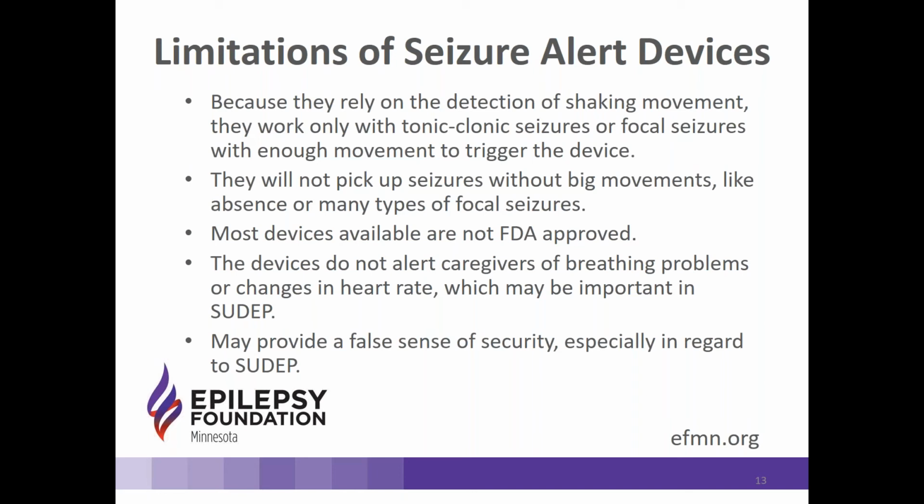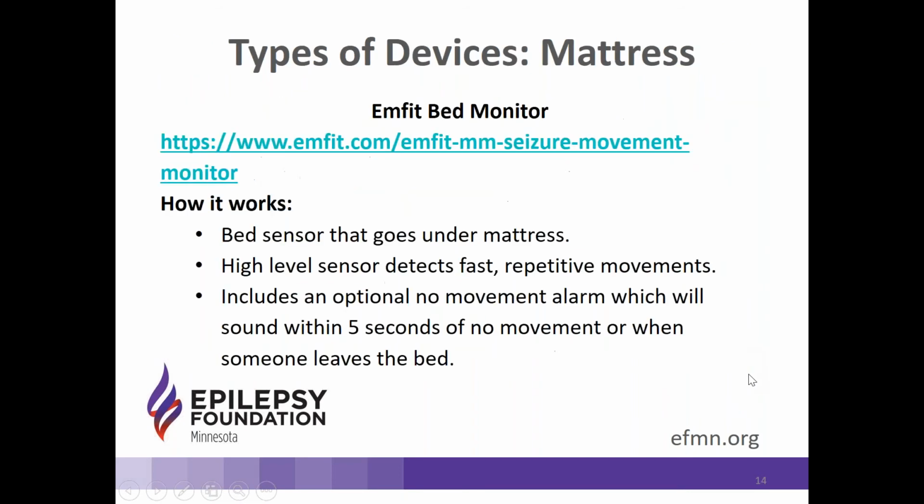The other thing I wanted to note is that what evidence is out there about how these devices work comes mostly from studies that have been conducted in hospital epilepsy monitoring units and sometimes in homes, but really more scientific study is needed to know how well they work in the real world. There's a lot of anecdotal evidence out there. There are people who use them and have seen them successfully identifying and alerting to seizures. But what is lacking right now is just the hardcore scientific research into them.